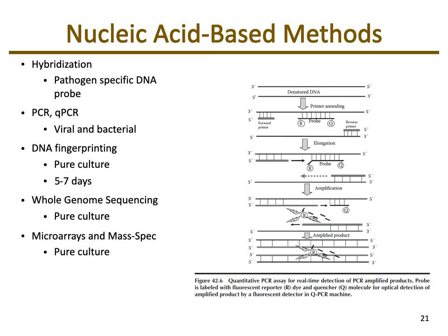With DNA fingerprinting, that can be utilized. However, you need a pure culture, so it can take 5 to 7 days from beginning to end, between culturing and then doing the DNA fingerprinting and getting your results. The same kind of downside applies to whole genome sequencing and microarray or mass spec: you need a pure culture.